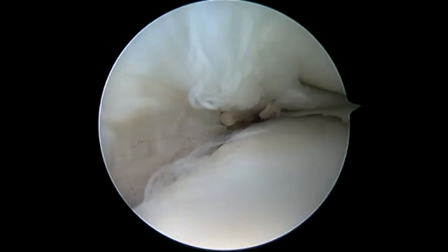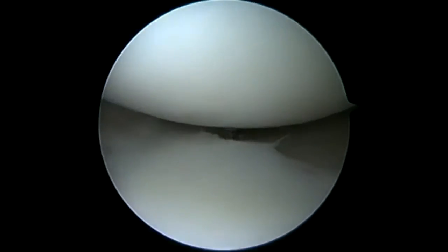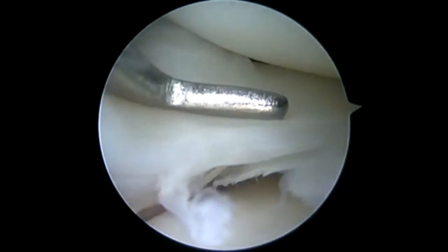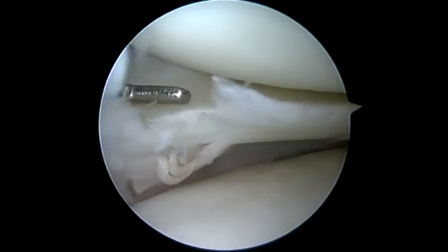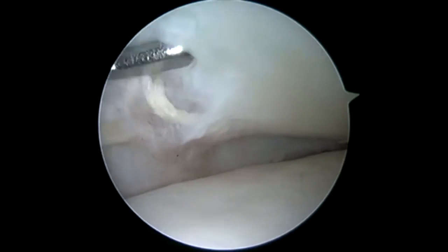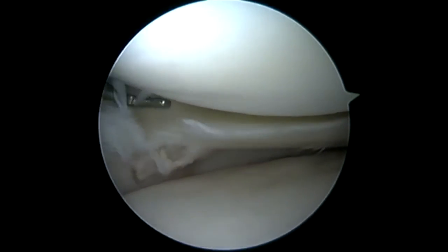You can see that meniscal fixator right there in the middle of the screen. Once we trephinate the medial collateral ligament, it'll give greater access to that medial compartment. Now we can clearly see this meniscal fixator is buried right at the meniscal capsular junction, but not through the capsule. You can also see as we probe the capsule how stiff it is along the meniscus and capsule where this implant is.